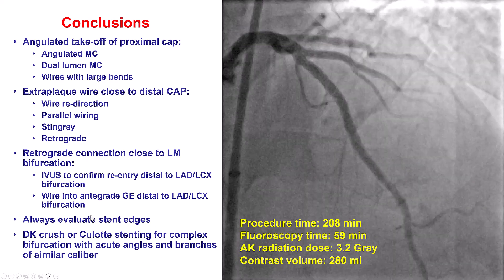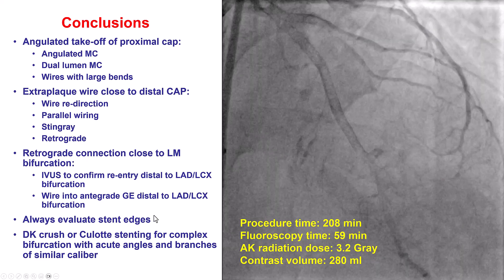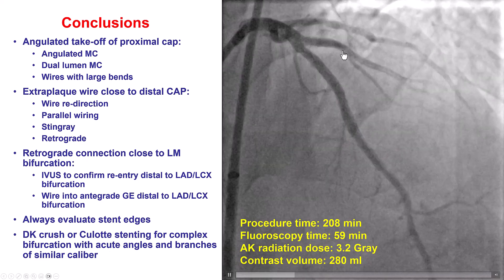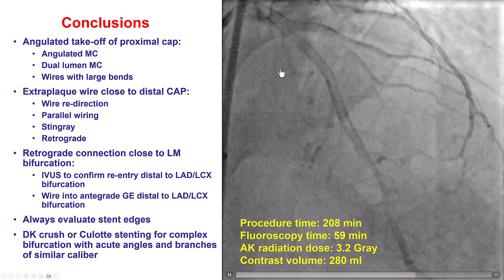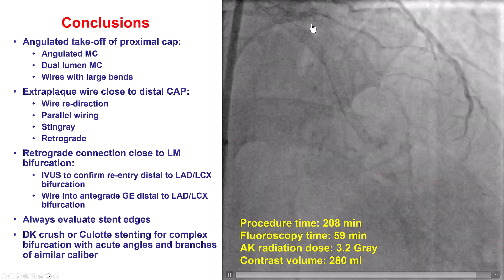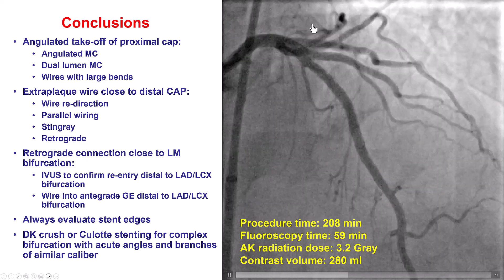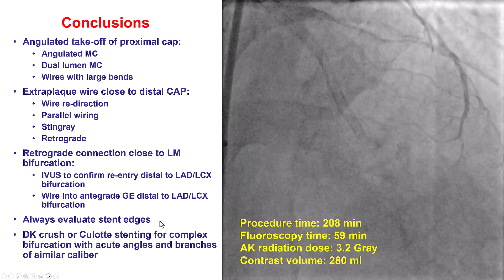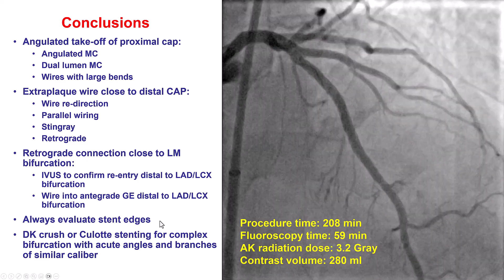There was a stent edge dissection that was stented. And when there is a complex bifurcation, sometimes it is best to use a two-stent strategy. Here we used a DK crush and had a very nice result.